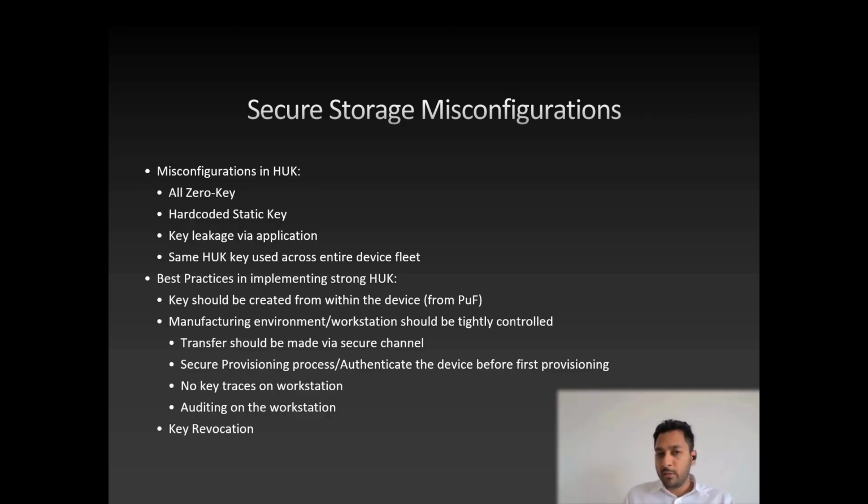Below are some of the best practices in implementing a hardware unique key. In the ideal case, a key should be created from within the device using a physically unclonable function. That's what Apple does, using the Secure Enclave in Apple devices.